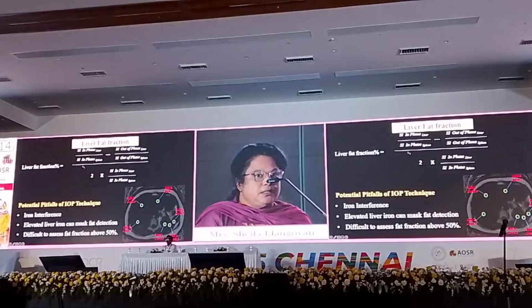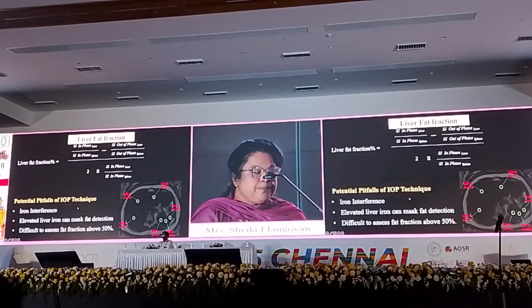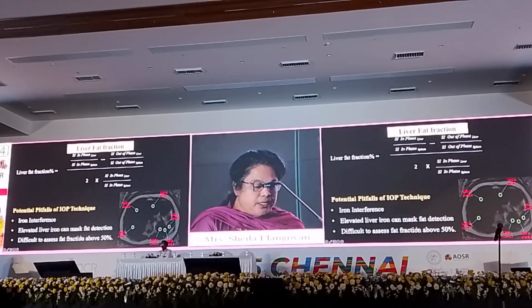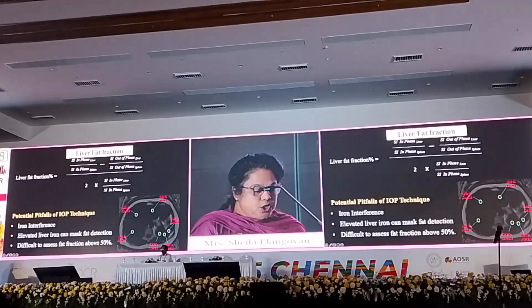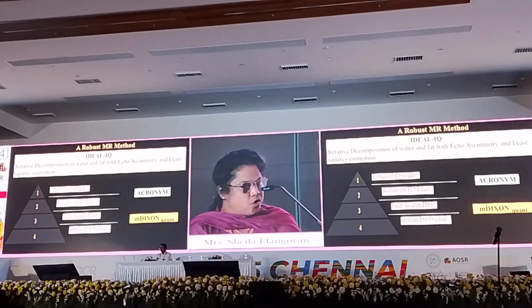But then, the limitation or the pitfall of this in-phase and opposed-phase technique is that there can be iron content in the liver which can influence the results, and elevated liver iron can actually mask or obscure the fat detection. So we need to have a better technique, a much more robust technique.